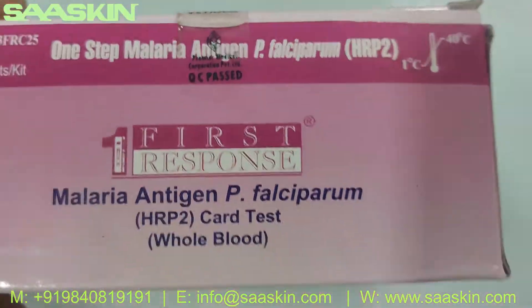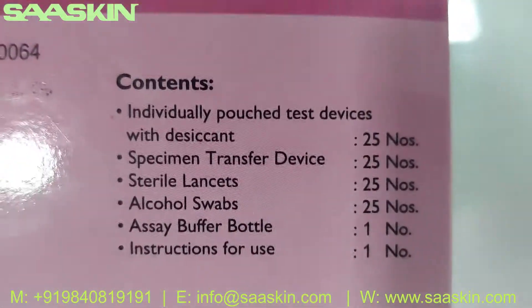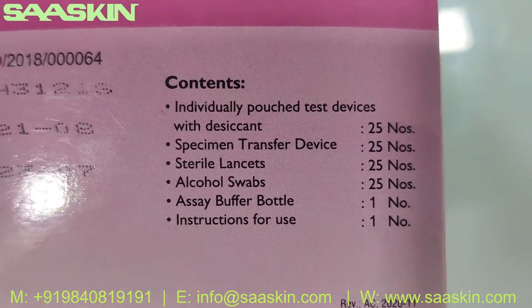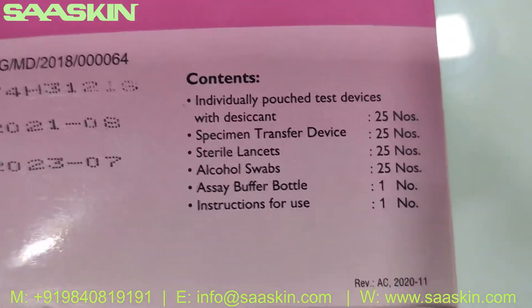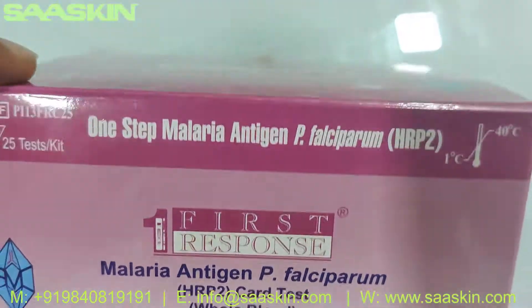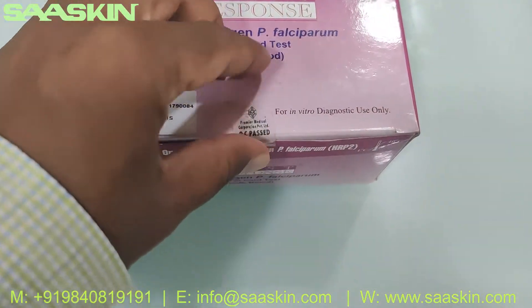Here you go — I can show it on the box. You can see the two years of validity standard. Inside you have 25 cassettes, 25 specimen transfer devices, 25 standard lancets, 25 alcohol swabs, one buffer bottle, and an insert for use. This is how the box looks like.